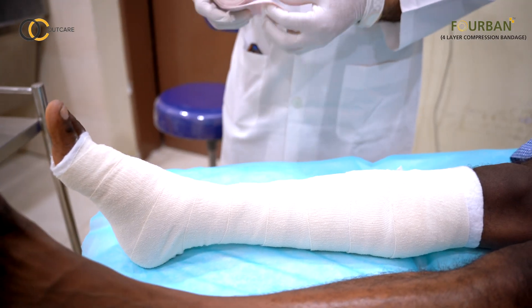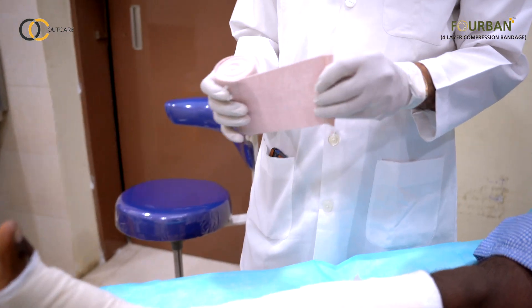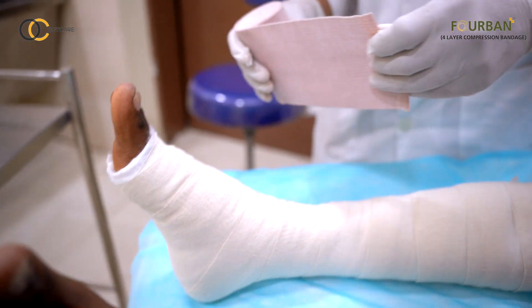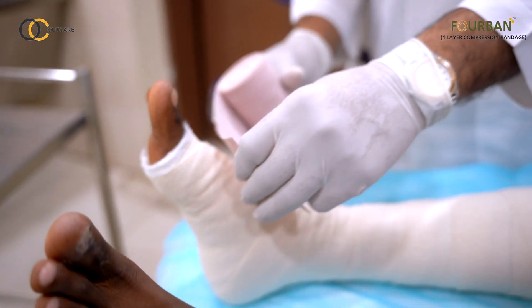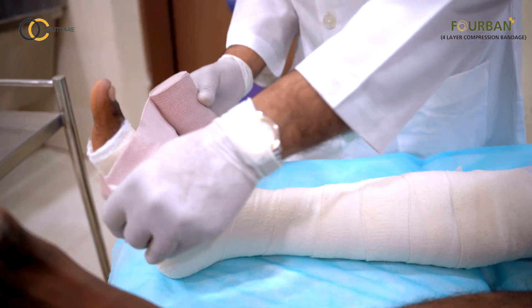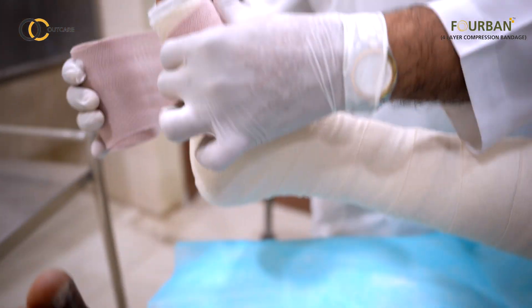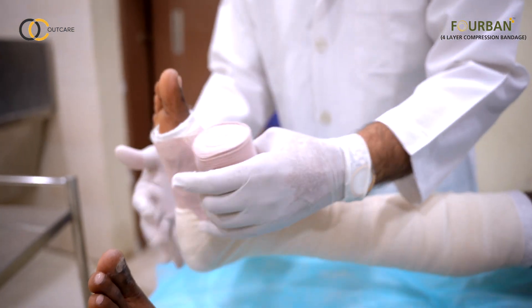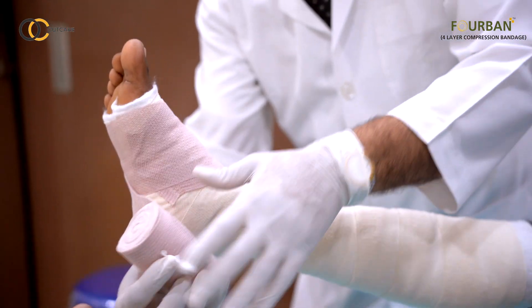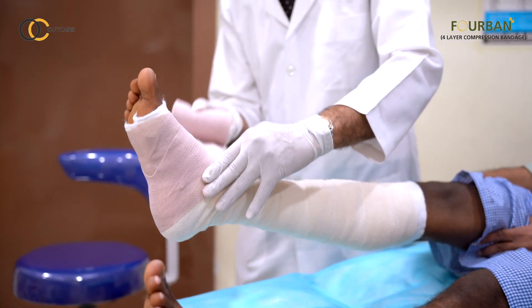Now we go to the third layer, which is the elastic compression bandage. This is the one layer among the 4 in which we need to go in a figure-of-8 fashion right from start to finish. We start at the base of the toes, stretch the bandage to around 50% more of its length, and proceed with 50% overlap in a figure-of-8 fashion.